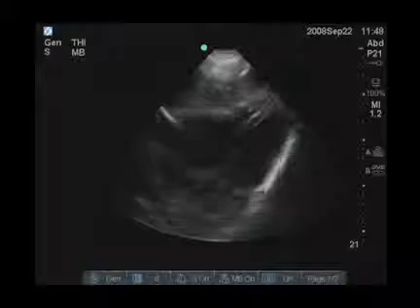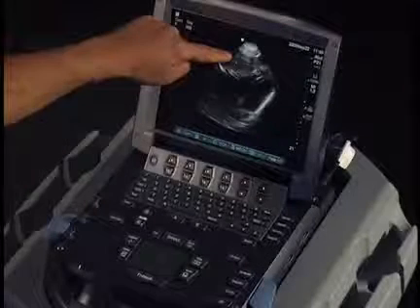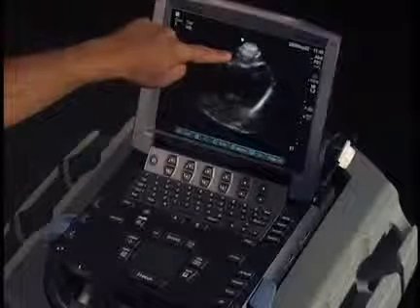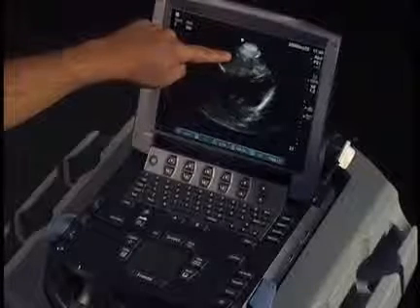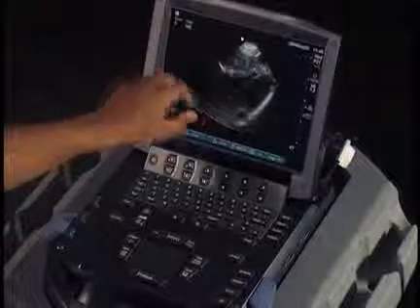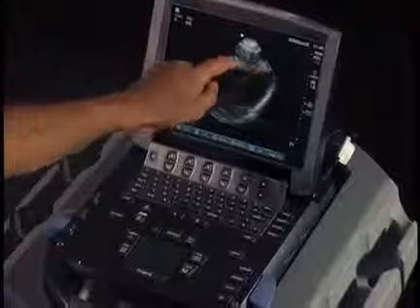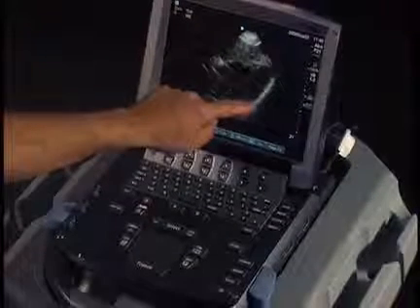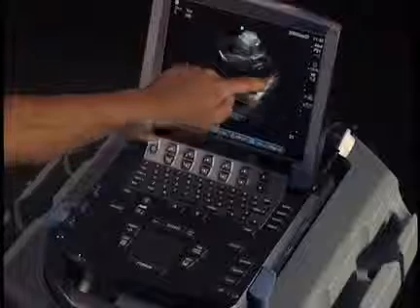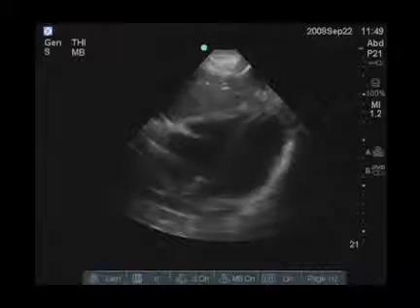Some common landmarks you need to identify: the first thing you see is the liver at the top of the screen. That liver is our acoustic window into the heart. The beating structure in the center is the heart, and we can identify the entire heart and its perimeter with the pericardium. The pericardium is a white line that you can see surrounding the full heart.